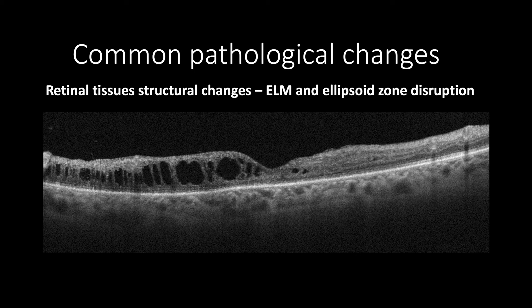This cross-section shows diabetic macular edema with intra-retinal cystic changes and disorganization of the inner retinal layer and loss of the central external limiting membrane and ellipsoid zone. Therefore, this case may improve anatomically after treatment but the improvement of vision is less likely.